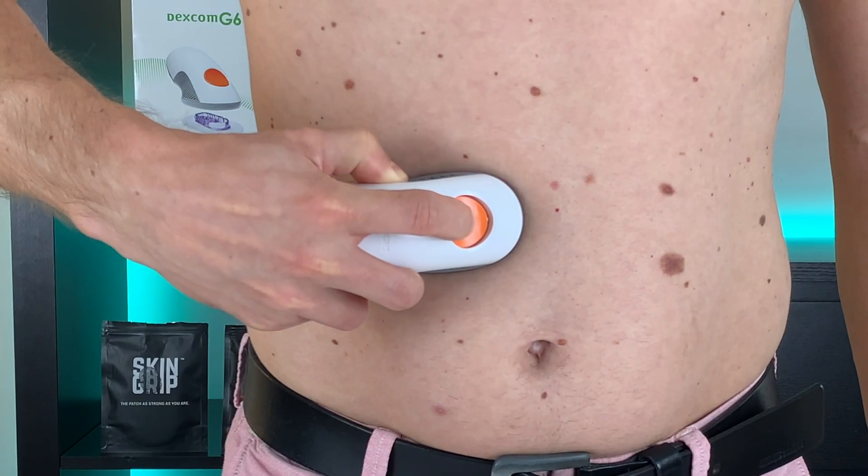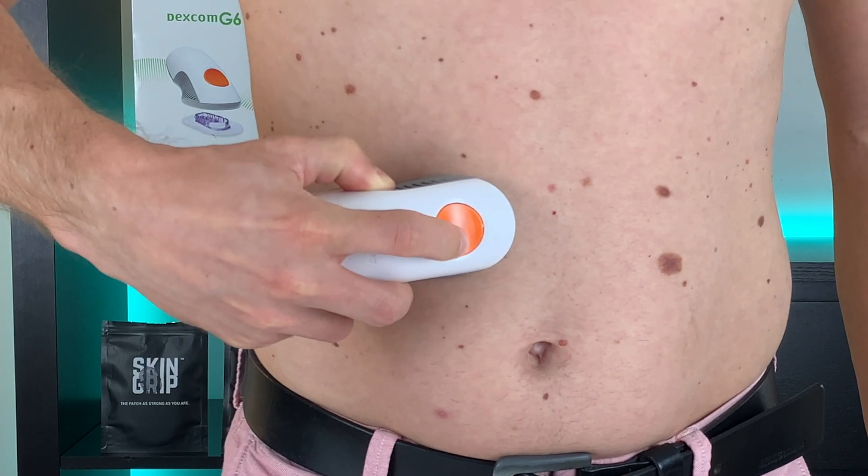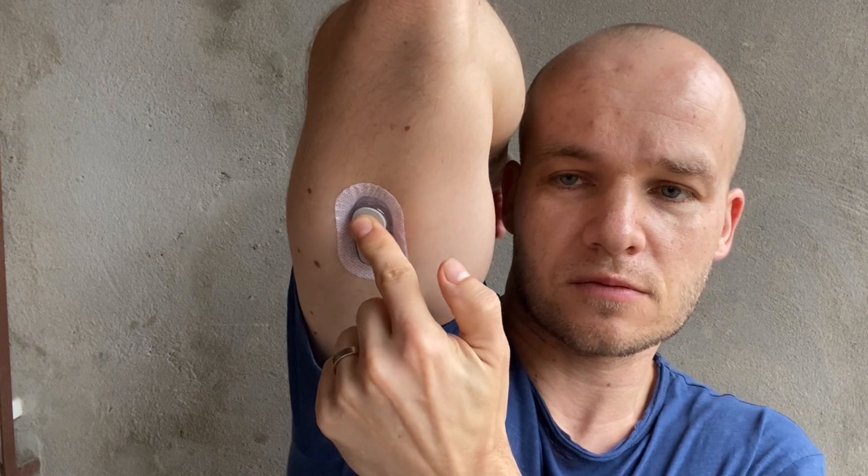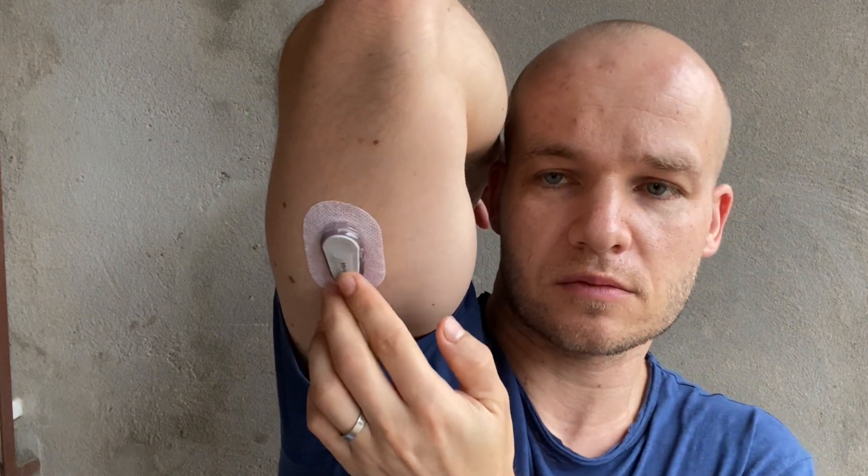So I experimented with upper abdomen, lower back, and upper arms. Although not all of these sites are officially approved by regulators, you might find out that some of them will work really well for you. I will be making a separate video about my favorite alternative sites for Dexcom really soon, so watch out for that one.